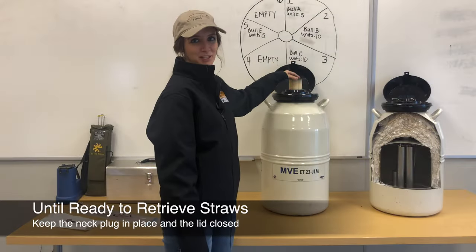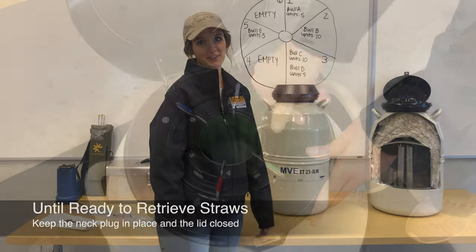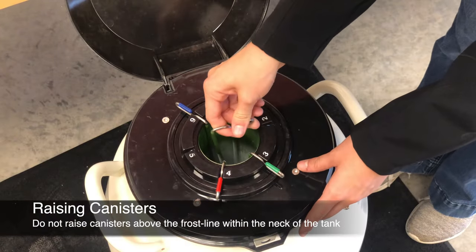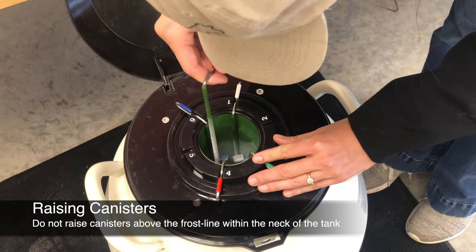Keep the neck plug in place and the lid closed on the tank until you are ready to retrieve the straws for thawing. Raise the canister until the cane tops are a few inches below the opening of the tank. Do not raise the canister above the frost line.